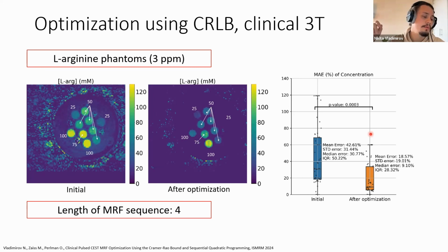And I figured out what's going on there. Actually, it's not only a field problem, there is also the problem of spin history: I was scanning a lot of sequences one by one, and they all affect each other. So yeah, I am figuring out what's going on there.